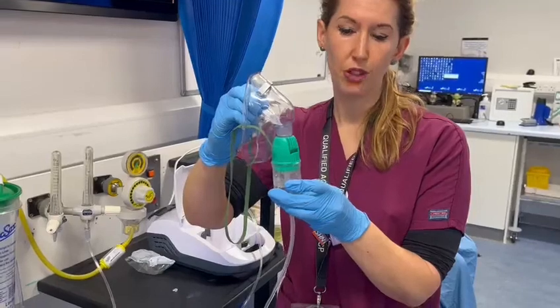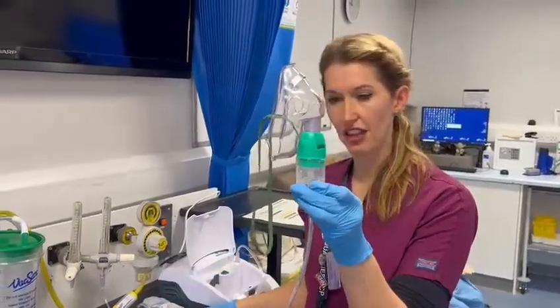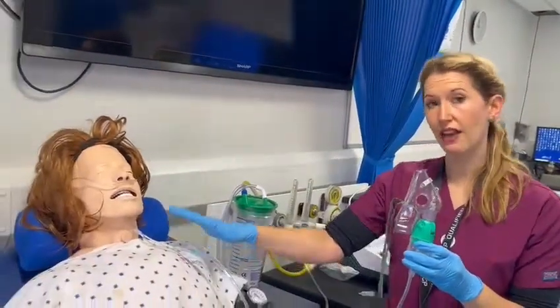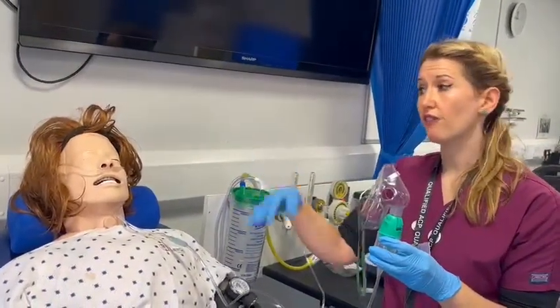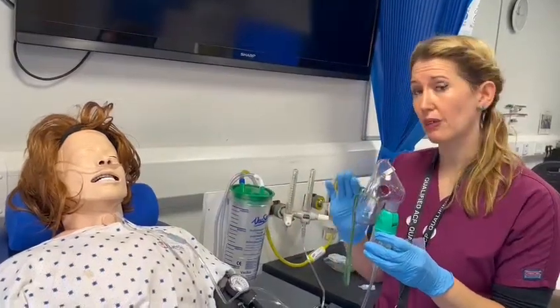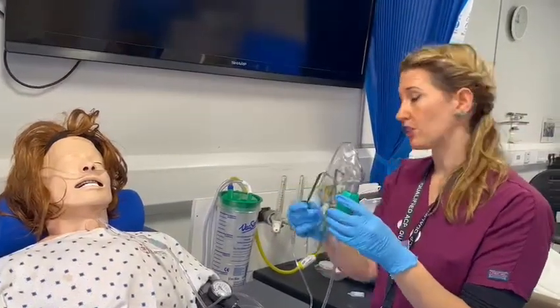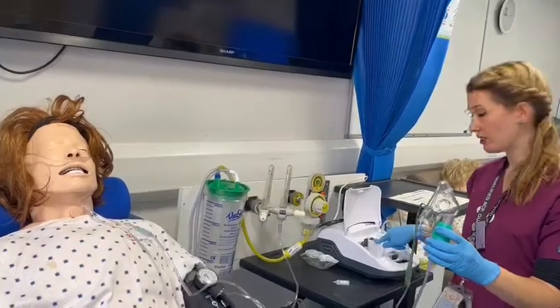You can also put the solution in before you put on the top of the face mask. The solution is now visible in the chamber. Our patient still needs oxygen — they already have a nasal cannula on, but if they had a venturi mask on, I would convert them to nasal cannula first prior to administering the nebuliser, because they still need oxygen rather than having it driven by oxygen.